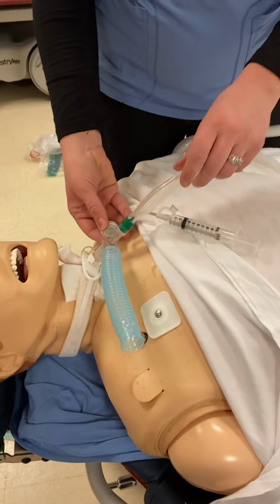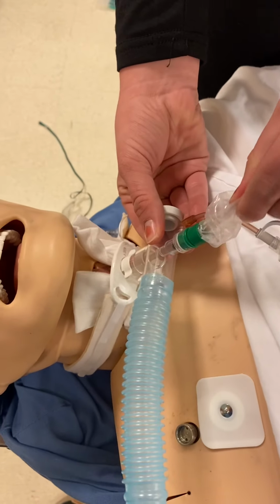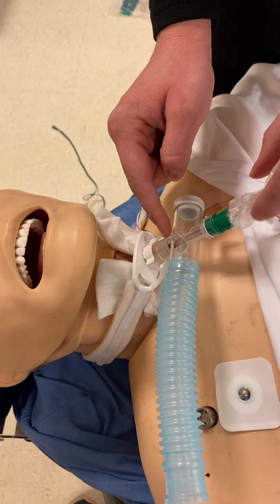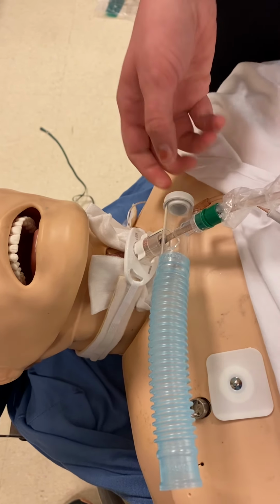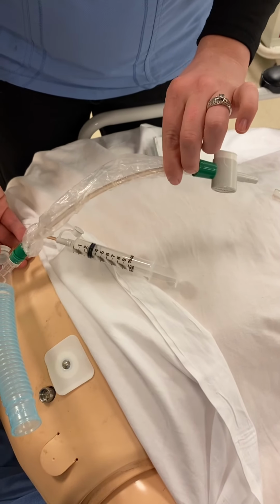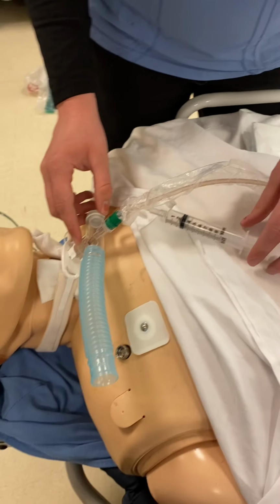So you're going to slowly advance the catheter, let the patient know that it's going to cause them a little bit of coughing, and sometimes it gets stuck on the inner cannula. You just want to twist until it goes down. If you're ever not able to advance this, you want to call respiratory right away to troubleshoot because you don't want to ever have this clog off.